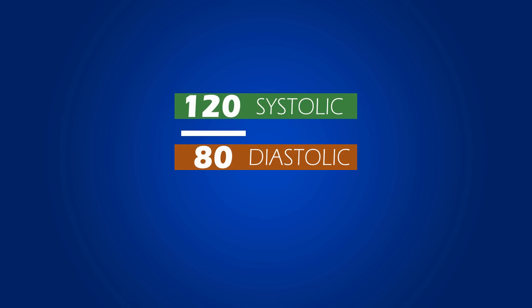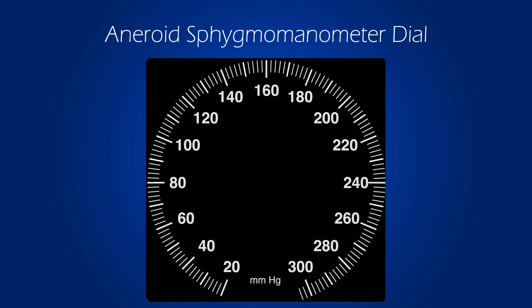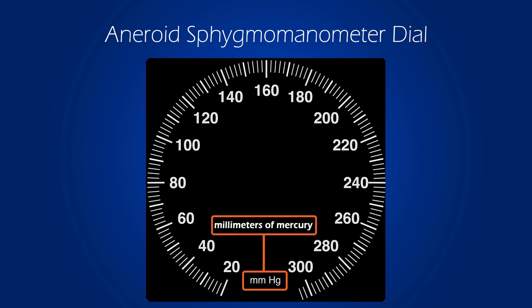Let's take a close look at the dial used for determining such a measurement. This is the aneroid sphygmomanometer dial, also known as the blood pressure dial. The dial has the letters MMHG because blood pressure is measured in millimeters of mercury.